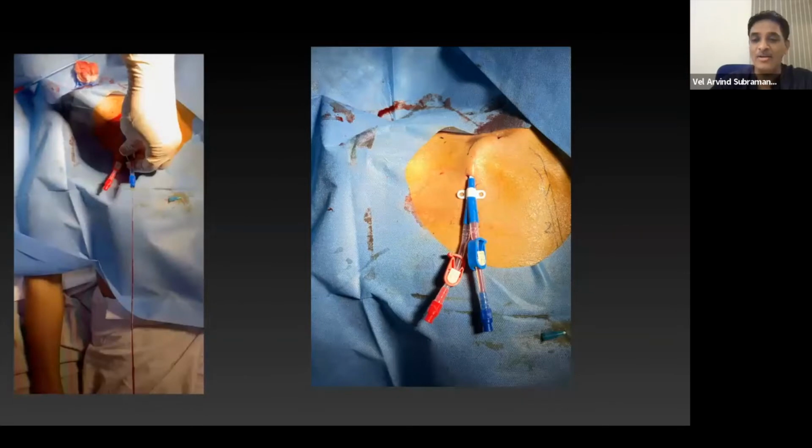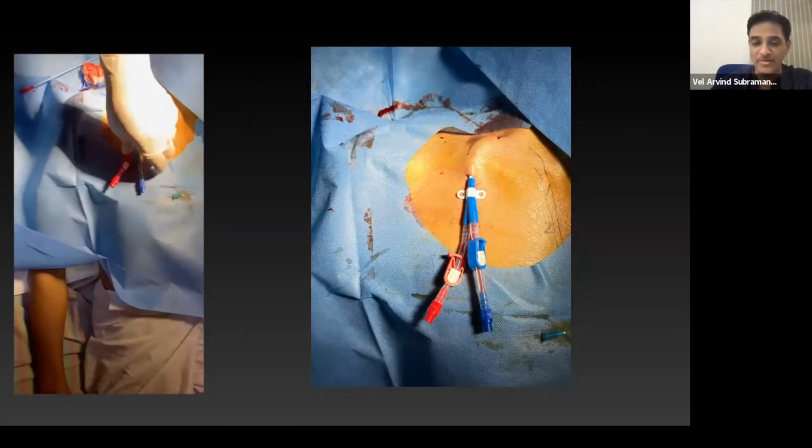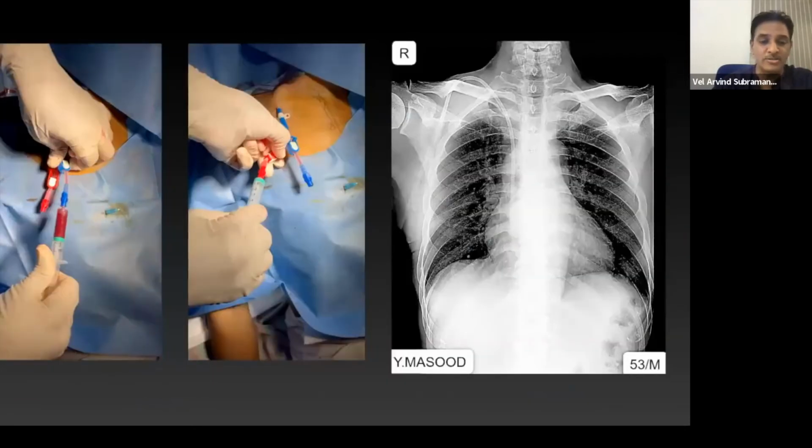And after the procedure, this looks exactly like a normal curved catheter. And now you see the position. So I just check the blood flow. I generally see the gush of blood, not just a simple flow. Gush should come, we make it 10 ml. Just here I use a 5 ml syringe, but if you get 10 ml, you just suck it, it will come very freely, which corresponds to good flow during dialysis.